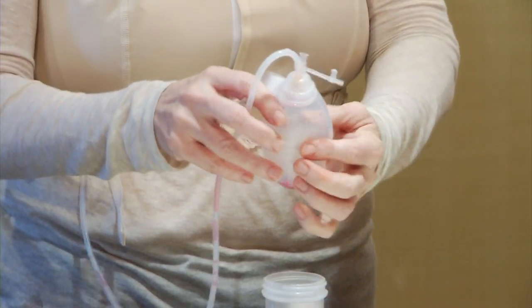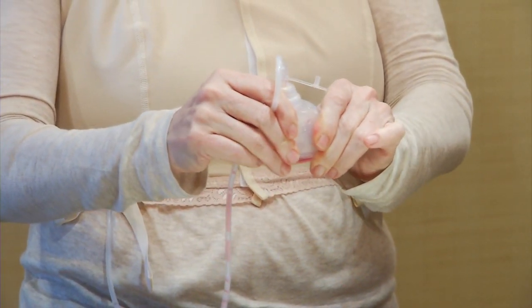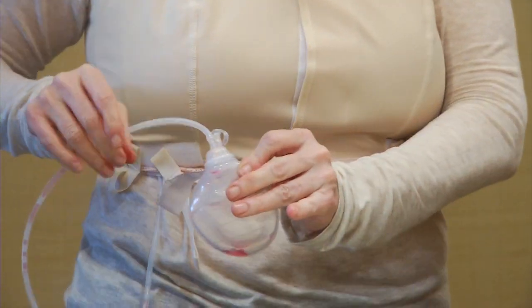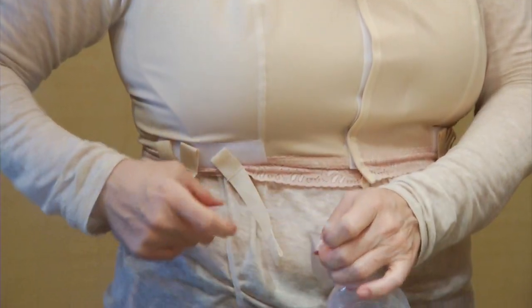Now turn the bulb right side up. Squeeze the bulb enough so that all the air comes out and keep squeezing it while you replug the stopper. The bulb should remain compressed so that it provides continuous gentle suction. The stopper must be closed for the drain to work.